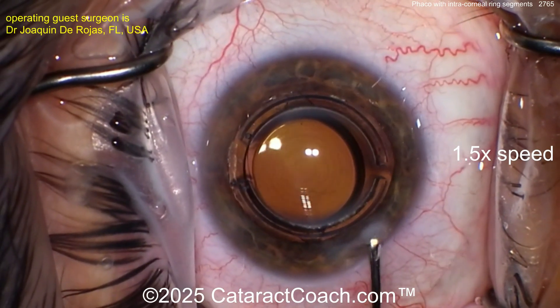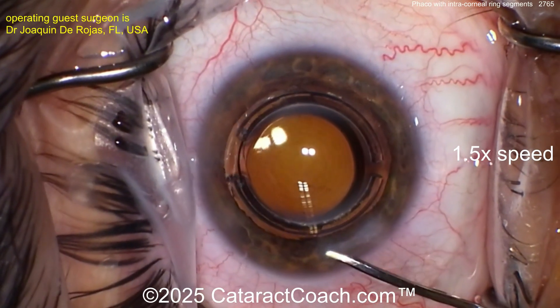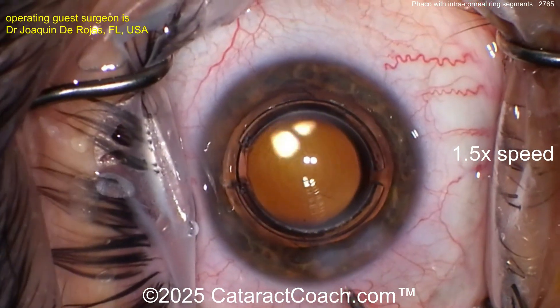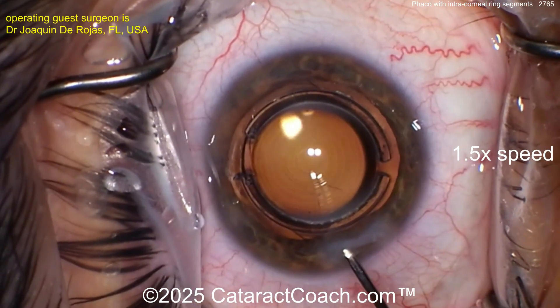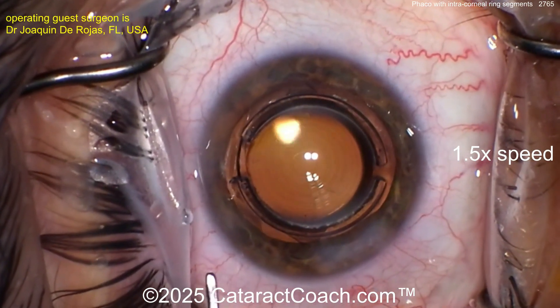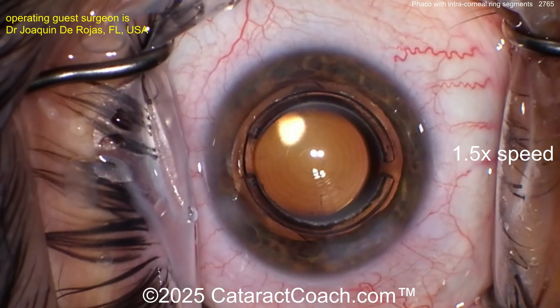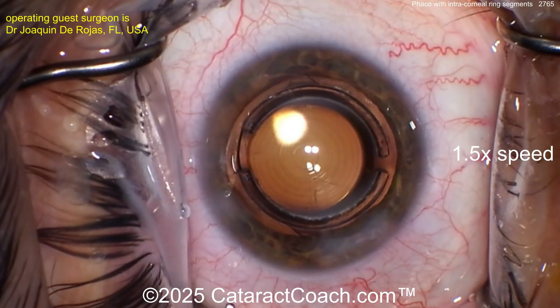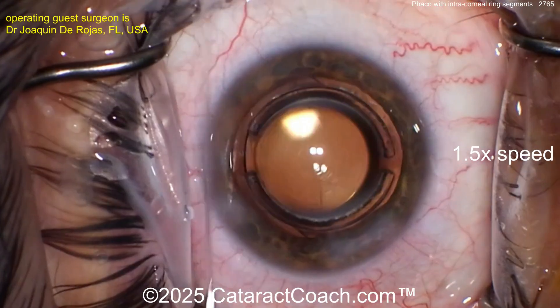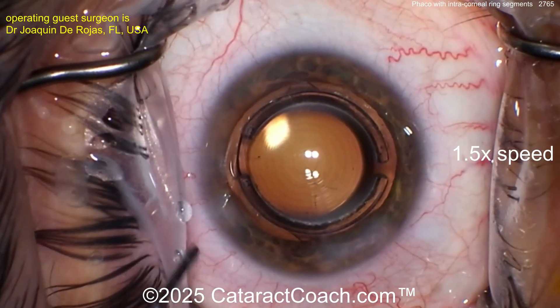Gentle hydration at the end of the case seals the incision. Remember, a beautifully constructed incision should not need a huge amount of hydration — just enough to seal up beautifully. Go through the side port, seal that up. That looks like a great case.